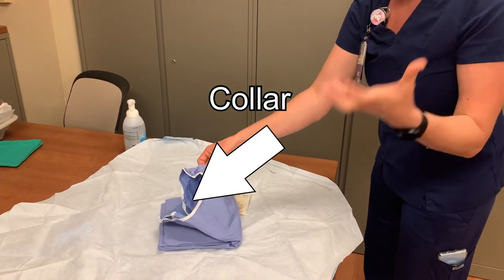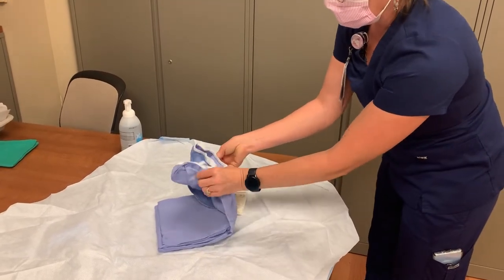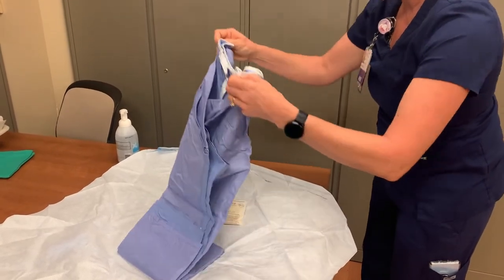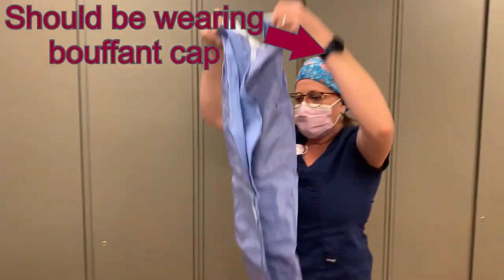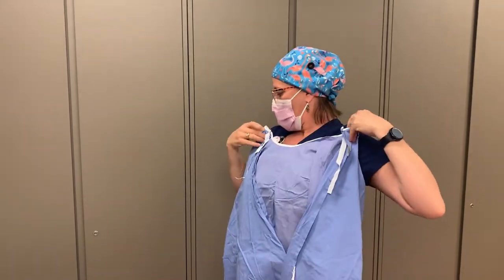The collar is trimmed in white. Hold the collar and follow it around until you find the corners of the collar with both hands. Gently open the gown, and when it starts to open, remove it from the sterile field and pull the corners of the collar apart to fully open the gown.